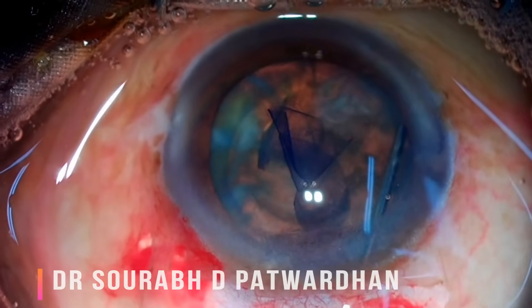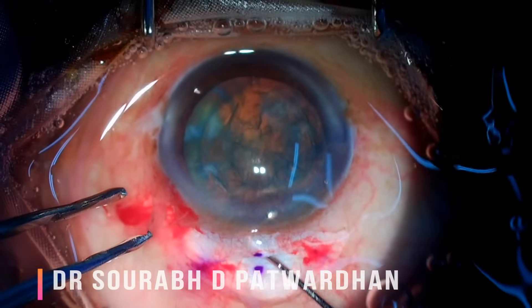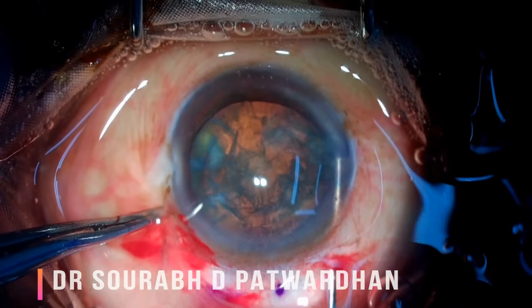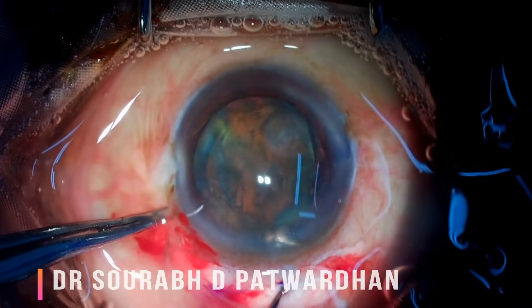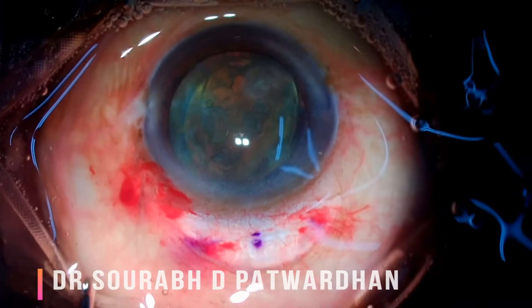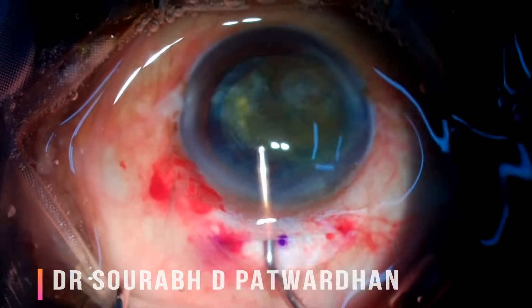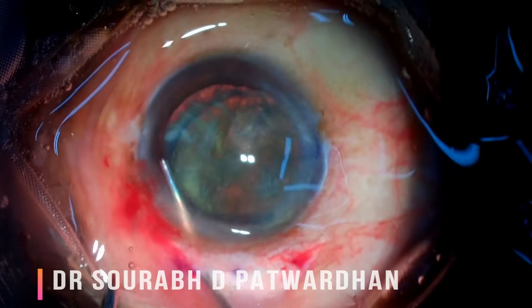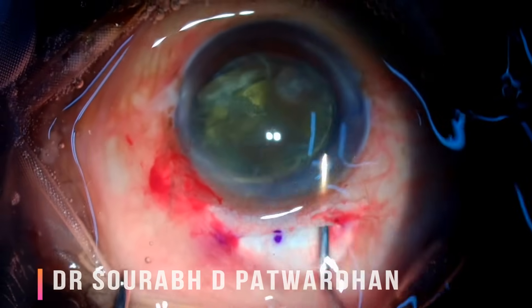Once the entry is made, I do hydrodissection from the main tunnel. I generally use a long Sinskey hook to lift the nucleus up, but here I am using a ball-tipped blunt chopper, which allows me to negotiate the equator of the lens very easily. Because it is a ball-tip chopper, it is very safe for the posterior capsule. This instrument makes bringing the nucleus into the anterior chamber a very easy maneuver. Once one pole is out, it is easy to rotate the nucleus into the entire anterior chamber.